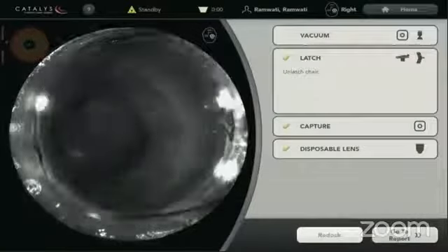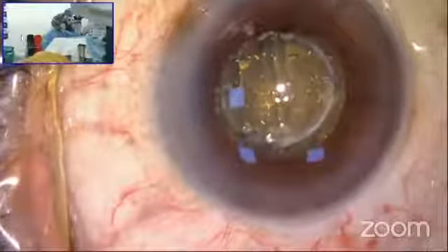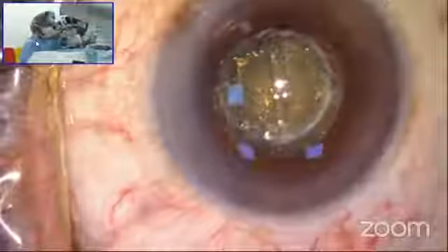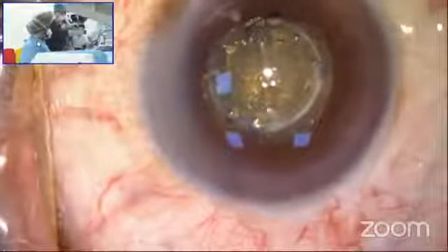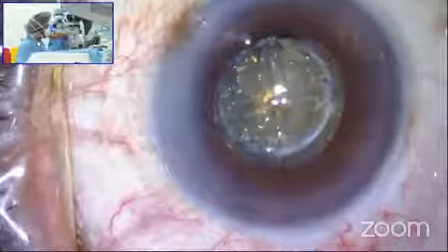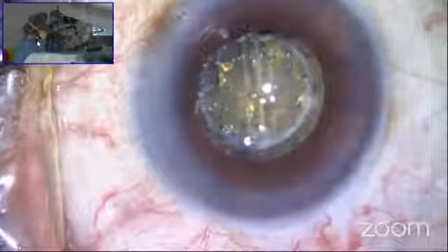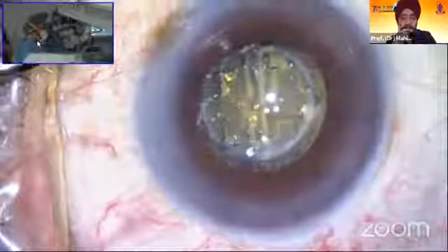Now this is the microscope view. You can see this LRI; I'll be making the incision at 180 degrees and that SIA had been taken into account for the surgery. The pupil has come down slightly — it was actually small right from the beginning. So I'll be using intracameral phenocaine. Phenocaine is a combination of xylocard, phenylephrine, and tropicamide.